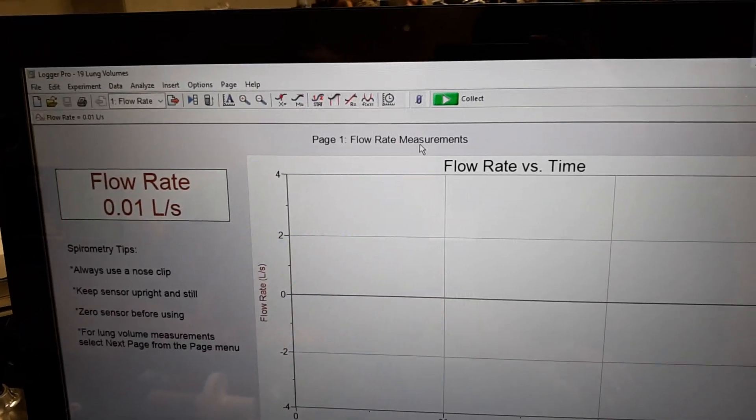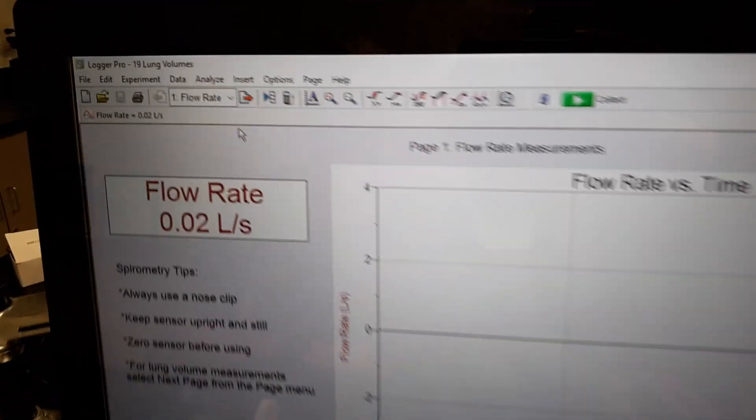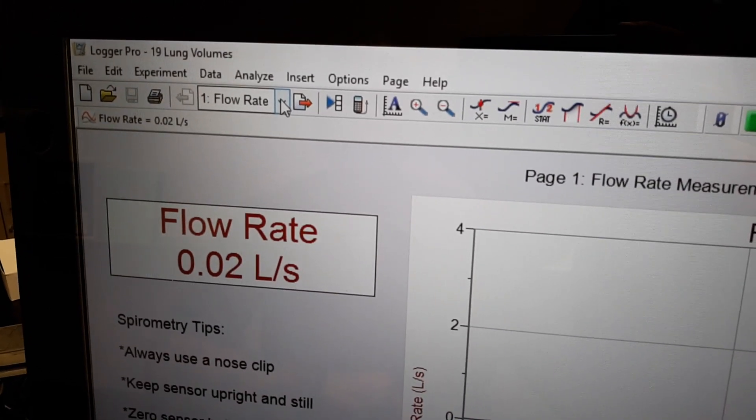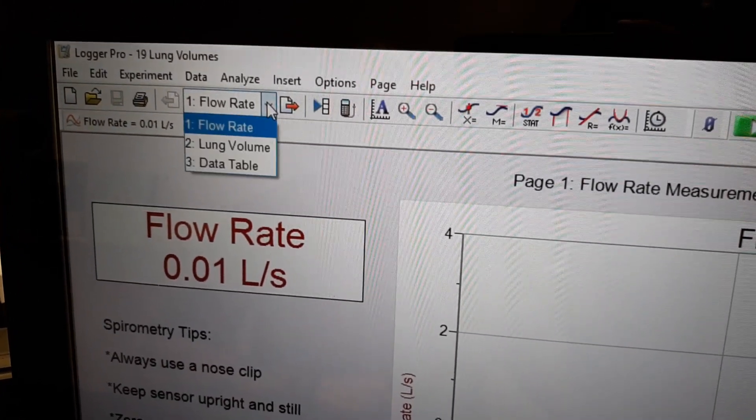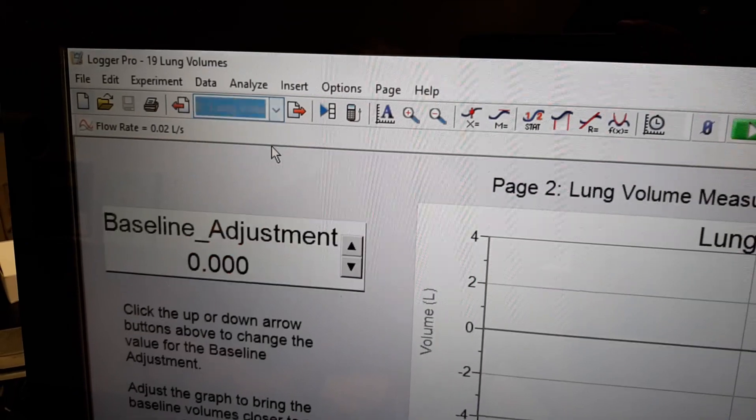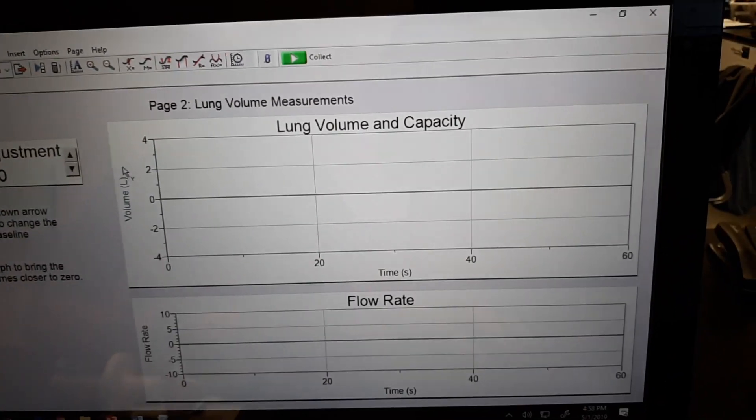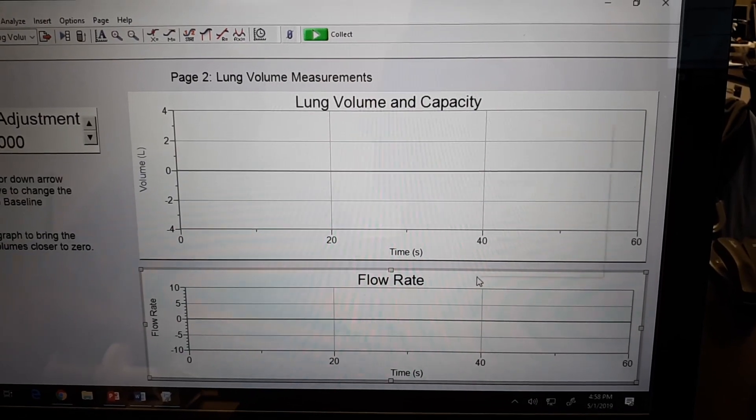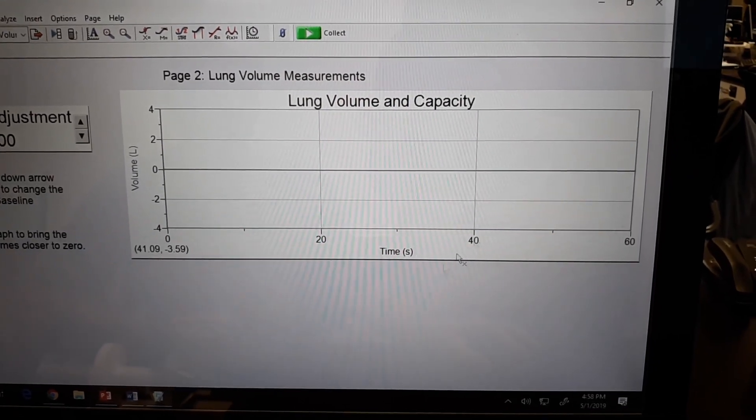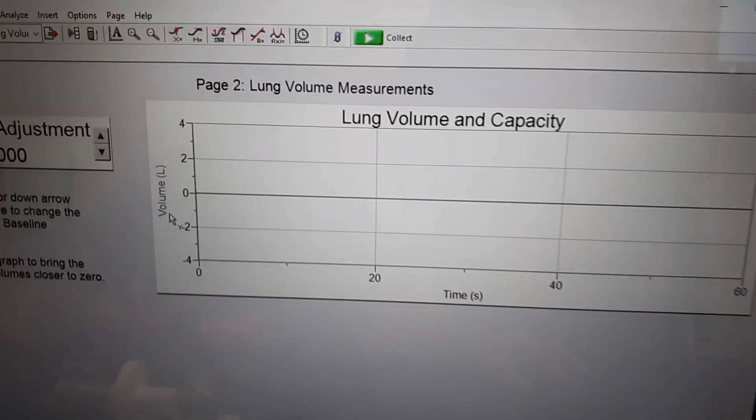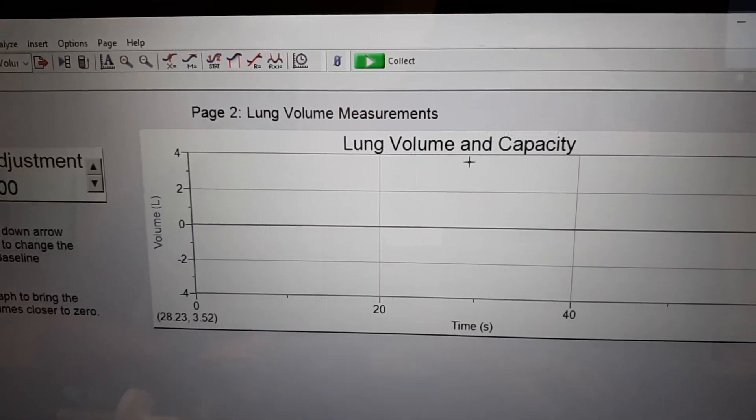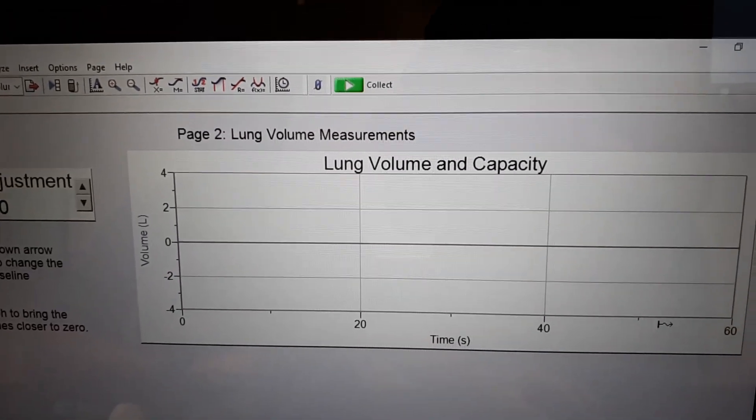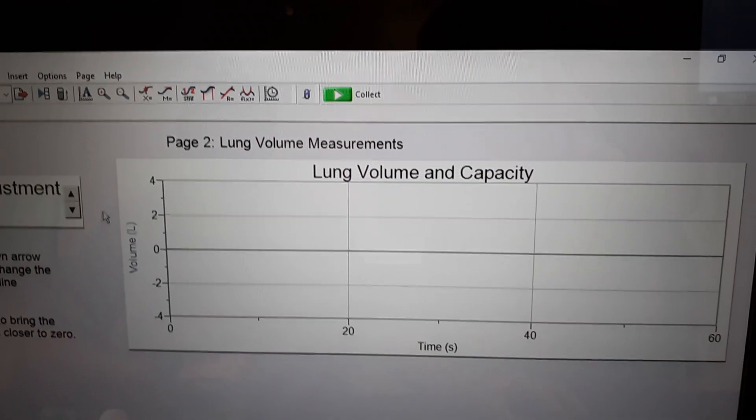And it should change you to this new one. So this one says flow rate measurements, right? What we want to do is go up to this little menu, drop down and choose lung volume. So notice what we have here. We've got two graphs. We're going to click on this graph and then we can just delete that one. On this, we've got a lung volume and capacity. So we have our time here. We have our volume over here.